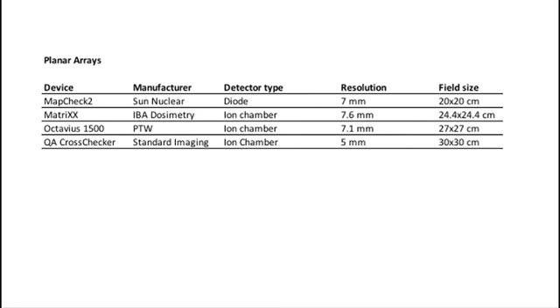And then these planar arrays, you can put them either directly under the beam, or maybe with some phantom material on top of it, or you could put them inside a specially designed phantom, like that might be, say, a cylinder or something, and then if you correct for the angular response of the detector, you could do an arc around the detector and get a good reading.